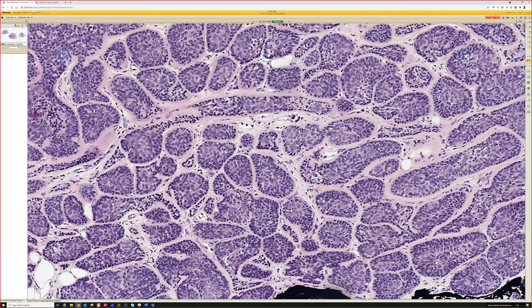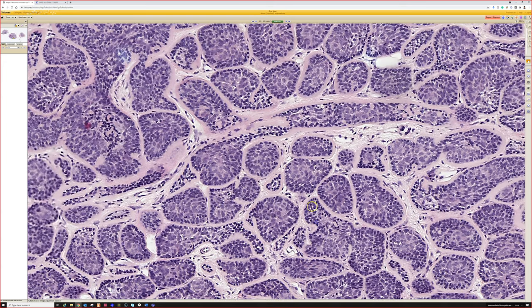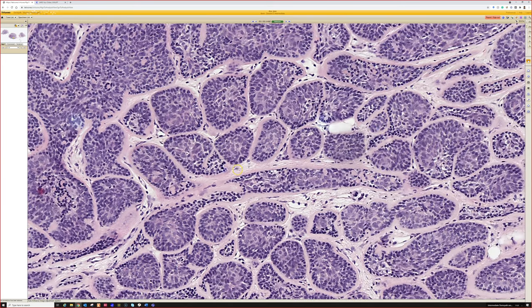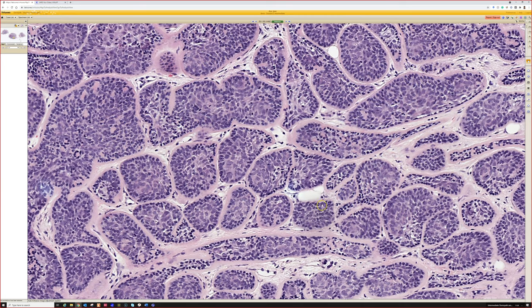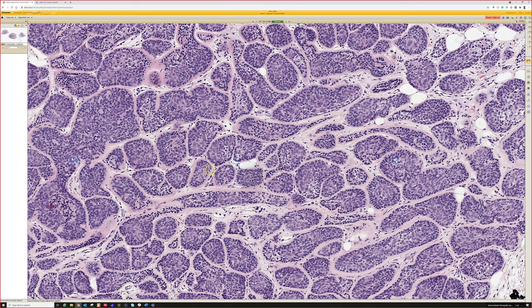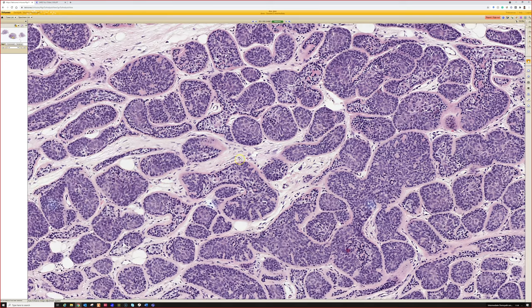So look, when you go closer to these things, they are blue cells. And people like to talk about two populations: really small dark blue nuclei, and then bigger, pale purple nuclei. I find that fine and all, but I don't feel like that's an easy way to teach it to beginners, even though it is technically true. But I think the molded blue puzzle pieces or giraffe spots, and then the really dense basement membrane, is the better approach. We showed basement membrane present in hidradenoma a minute ago, but it's usually much more prominent in cylindromas and spiradenomas.